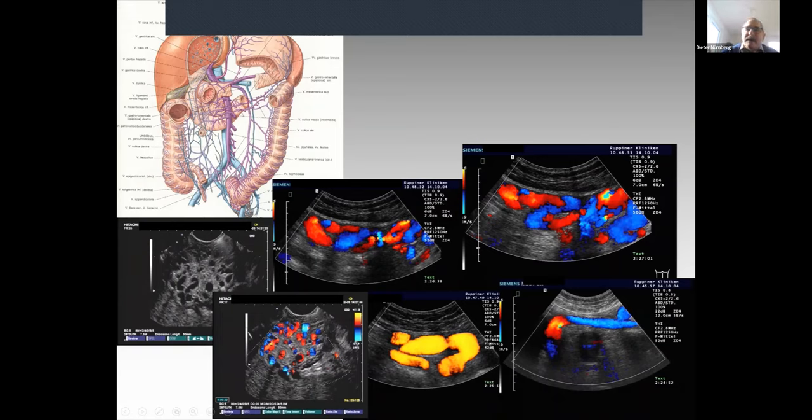It's going in the direction of the probe, and then it's going from the probe to the umbilicus inside of the abdominal wall, and that is a recanalization of the umbilical vein. And it's going into a caput medusae and a convolute of collaterals inside of the abdomen.